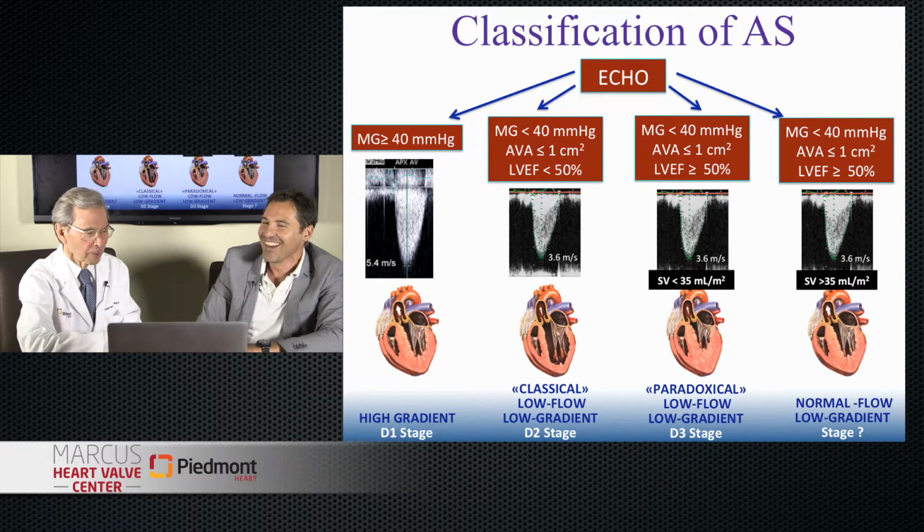So how do we tell? That's good. You know, when I was in my early days in cardiology and we were in the early stages with CW Doppler, it was just, if you had a high gradient, you had that. But things have changed, and I think this is really important. So let's let you continue.